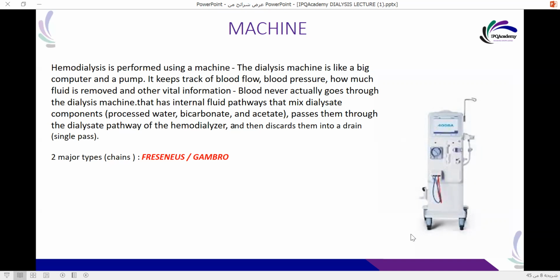Let's use our pen and imagine together. Here is the pipe carrying the product water, or the processed water, from the water station. Let's imagine this is the water station, and this is the water.